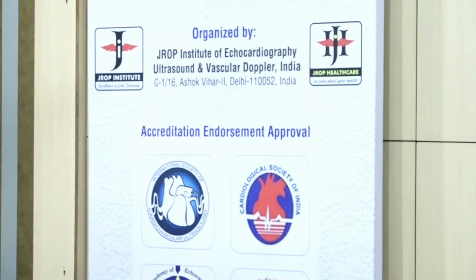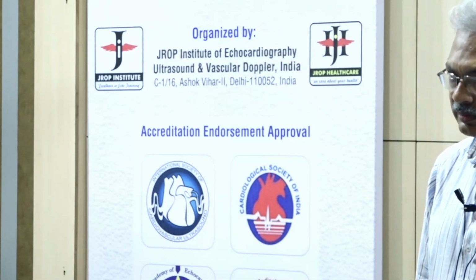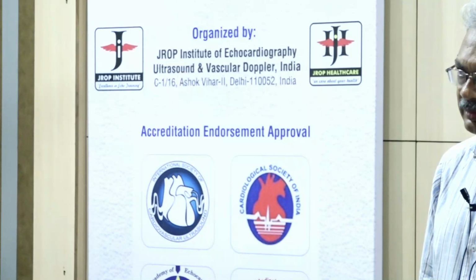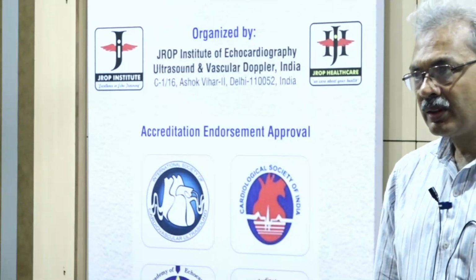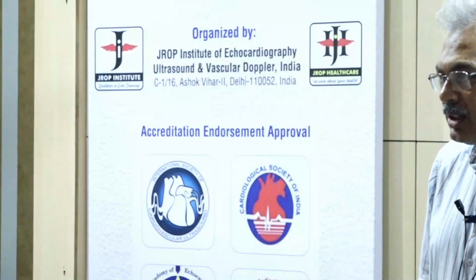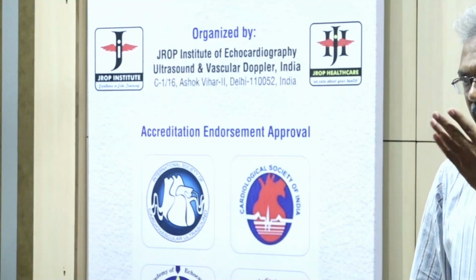When you see a thin rim in 2D, the chances are very low; sometimes you see only the edge of the rim. If in real time we take the image, you can see the entire thickness of the rim. Sometimes, even though in 2D the rim looks thin and floppy, the amount of tissue is spread out. So if you can see the thin floppy rim across this, you can measure the thickness too. I will not disagree with you.